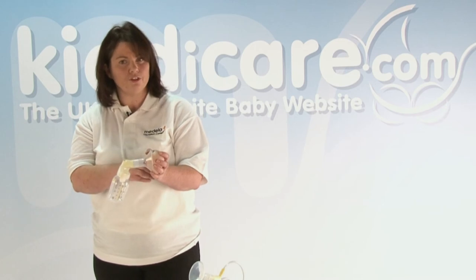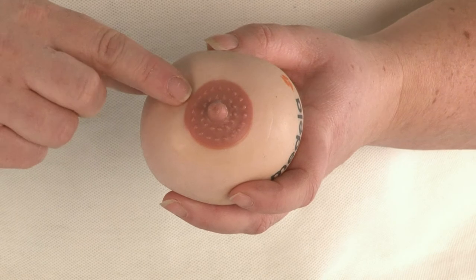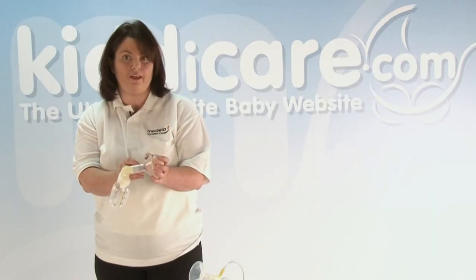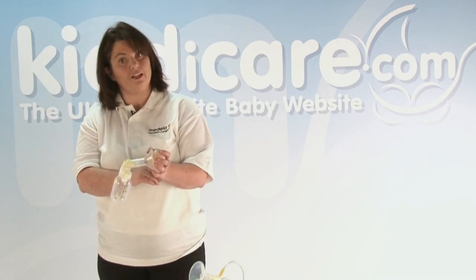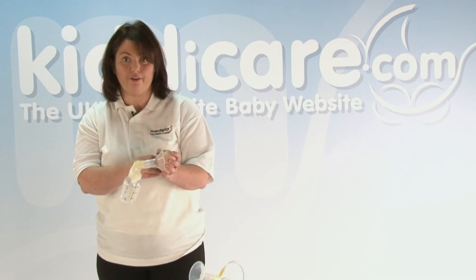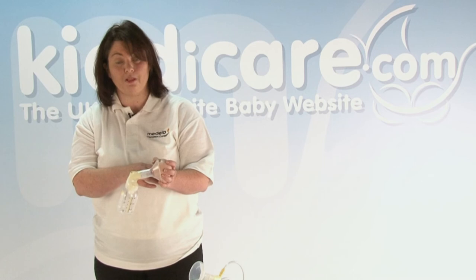How much areola should go in? Well, areola is the brown part of your breast. You're looking at a very small amount. So if it's only nipple in there, you may find that this shield size is too small for you. But if you're finding that a lot of the areola and some of your breast tissue is going in there, this shield size is too big for you.